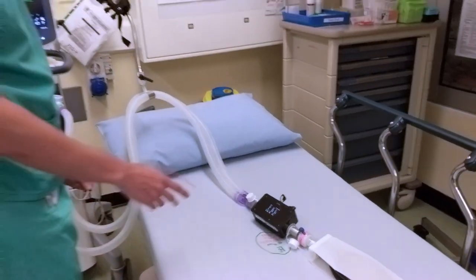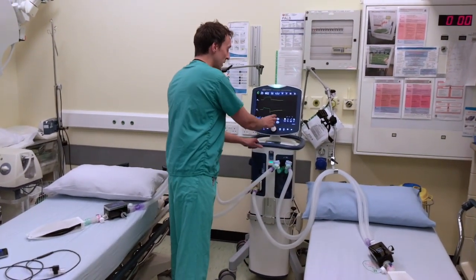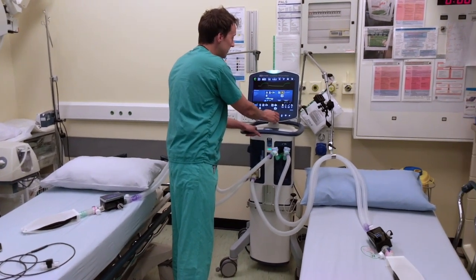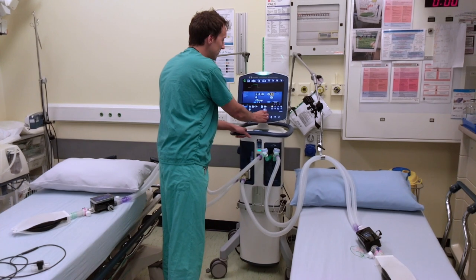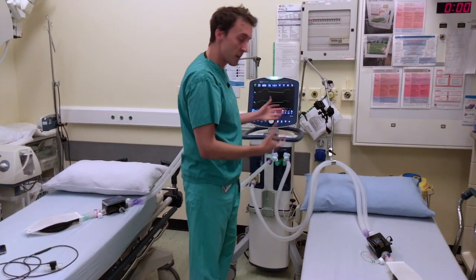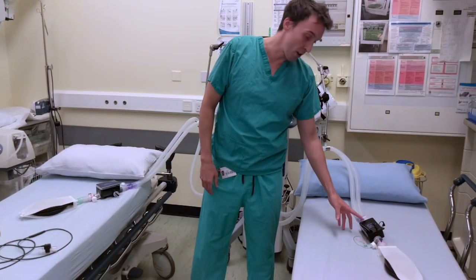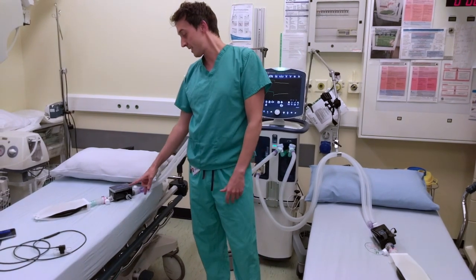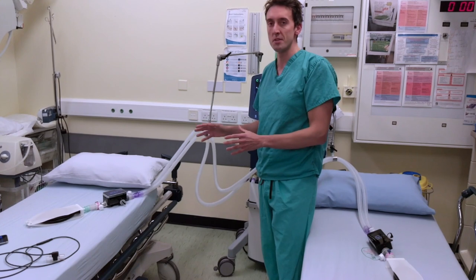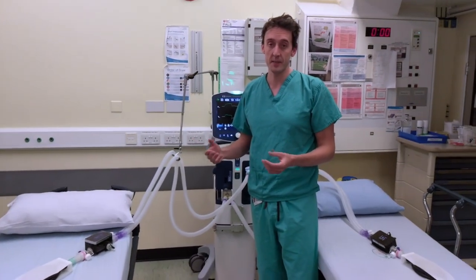Getting a tidal volume there for each breath of 411, and then we can return and put the FiO2 back to the original level. And so now we have the system in essentially the state it began in. Tidal volume here, 411 mils per breath, 395 mils per breath on this. And at no point did we set up any warning alarms or risk any damage to each patient.